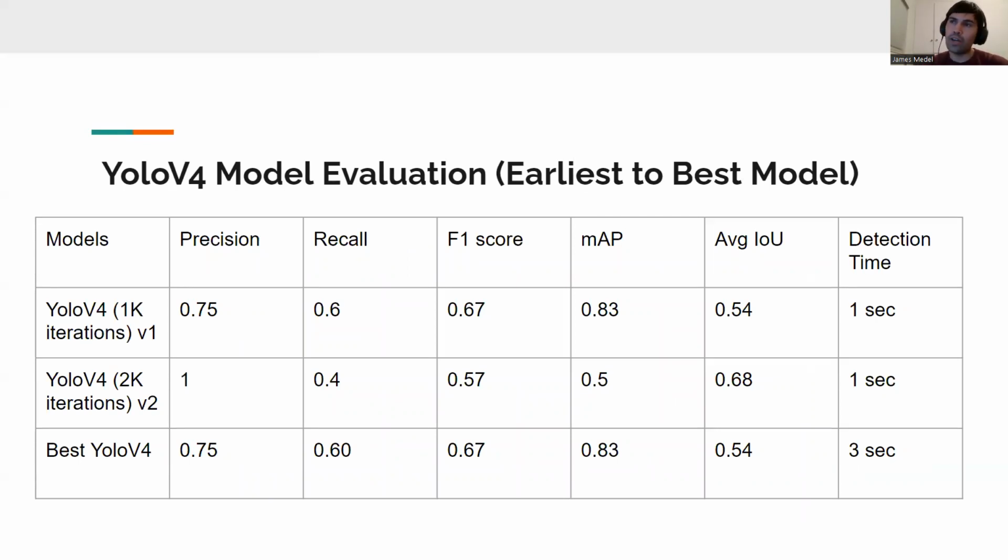For the case of YOLO, I used a fraction of the training set, 7,000 images, again from the original training set. In the table here, each row shows a particular model based on its iteration, or epochs as some call it.